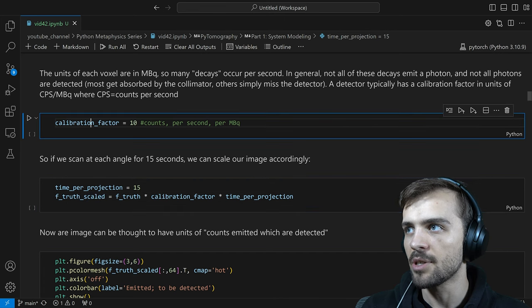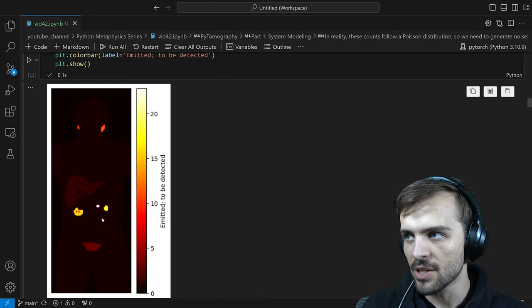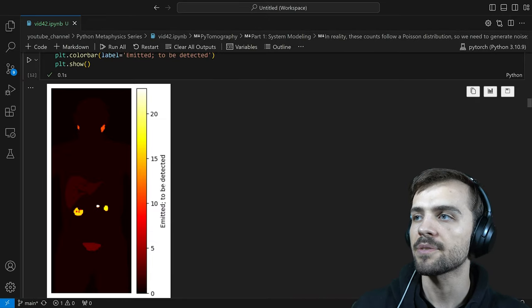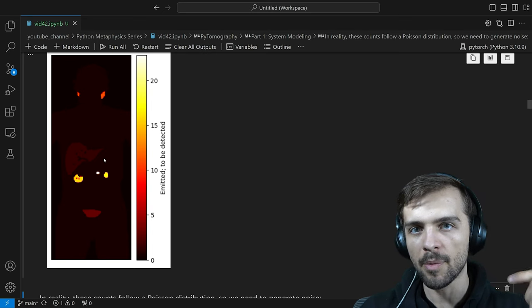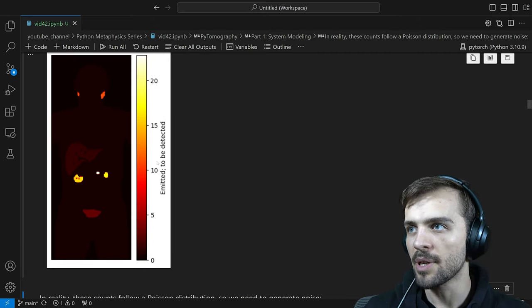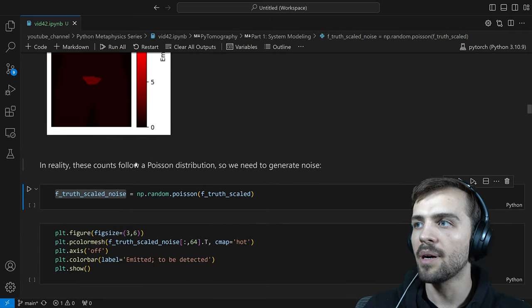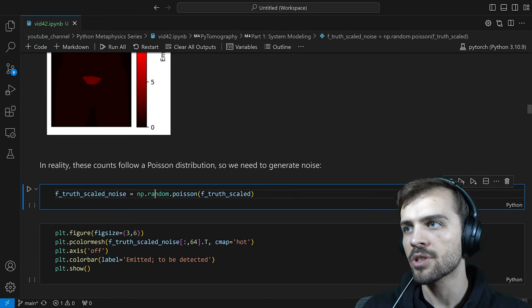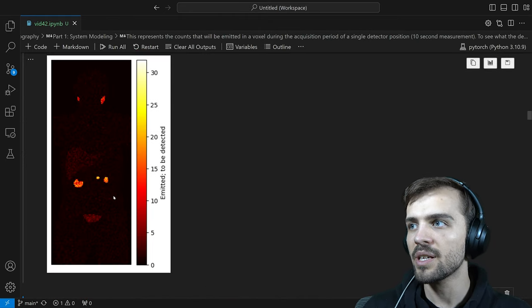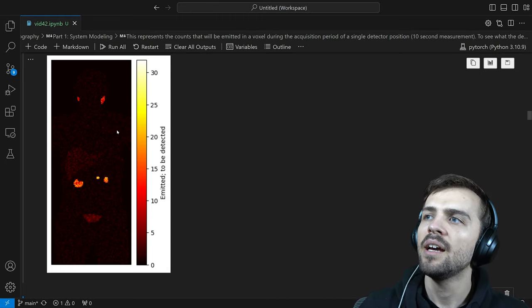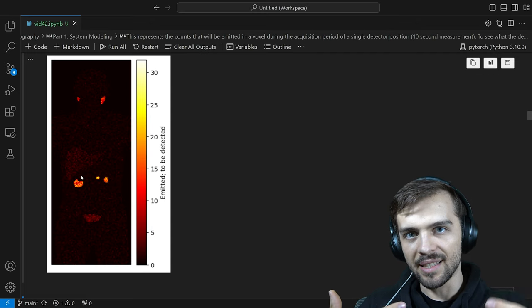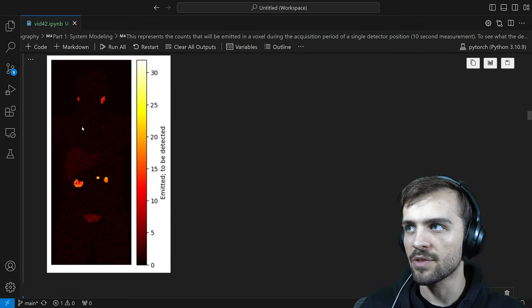We can use this calibration factor assuming we scan for 15 seconds per projection. Multiplying megabecquerels by time per projection gives units of counts — our scaled image. These are the photons we expect to be detected. In reality, these counts follow a Poisson distribution — radioactivity is essentially random and Poisson distributed. So this represents the mean of the Poisson distribution. We can call the NumPy random Poisson function on this to get F_truth scaled with noise — the number of counts that would actually be detected.